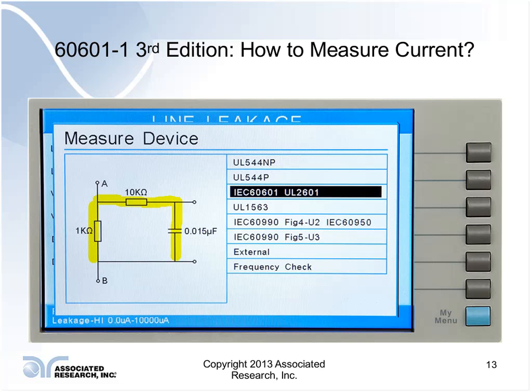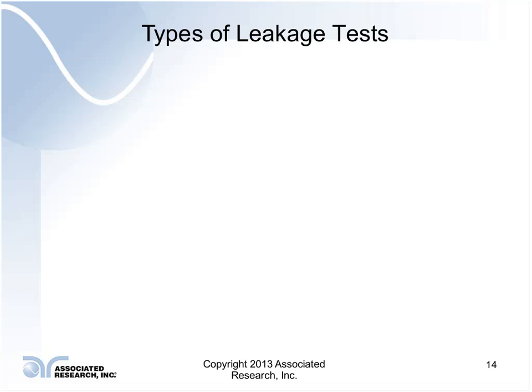With the human body, there's going to be some capacitance involved. So we want to know across a broad spectrum of frequencies, I believe all the way up to 1 megahertz, how much leakage current somebody's going to be exposed to. So your MD and your leakage testing device should be able to measure those leakage currents over a broad frequency spectrum. That's very important. Granted, you're only powering it up at 50, 60 hertz, but those other frequencies are on the line. They will exist, and that's going to affect your readings.